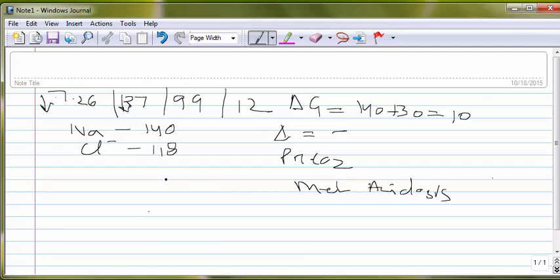Okay, let us see Winter's formula in this. Bicarb has dropped by 12 units, PCO2 has dropped by 13 units, which is closer to 1 by 1. So which is pretty much a straightforward normal anion gap metabolic acidosis.